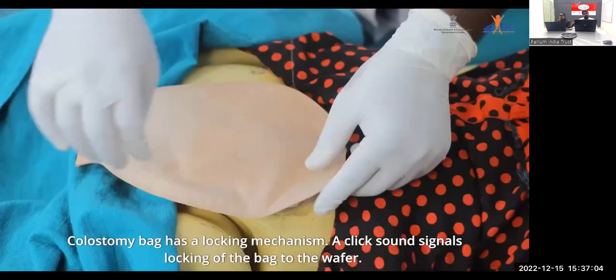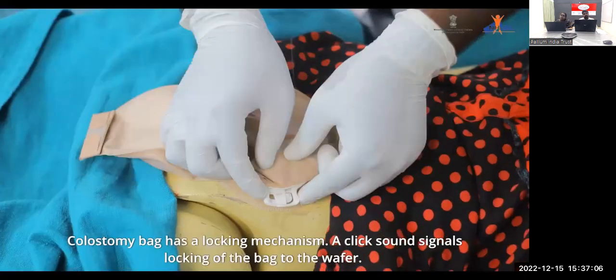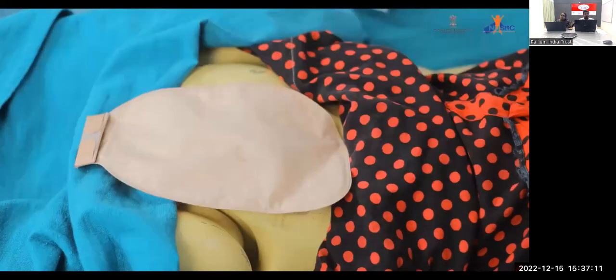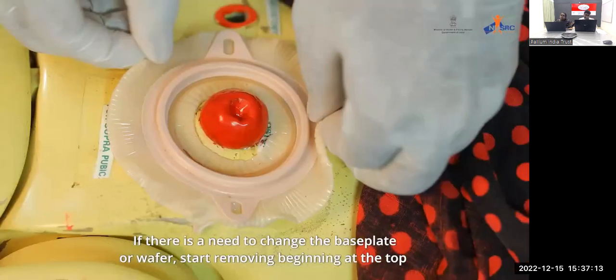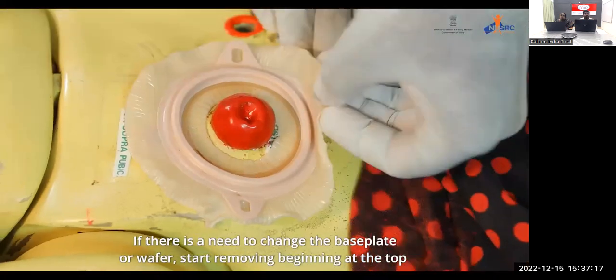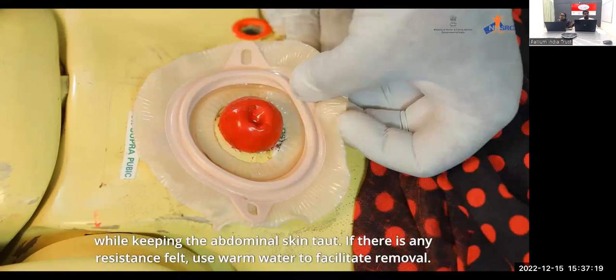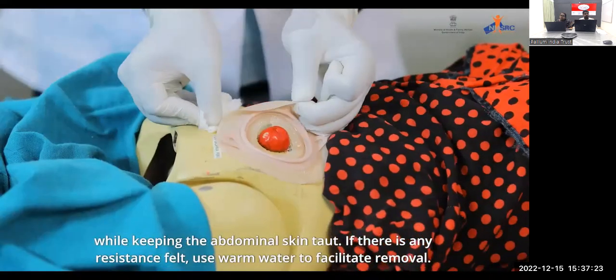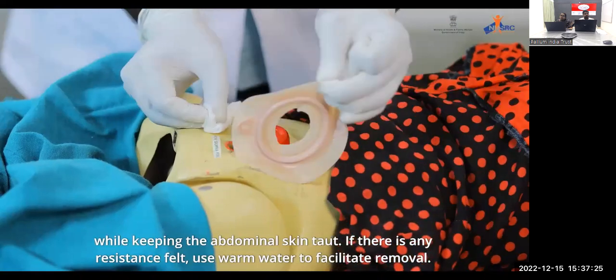The colostomy bag has a locking mechanism. A click sound signals locking of the bag to the wafer. If there is a need to change the base plate or wafer, start removing beginning at the top while keeping the abdominal skin taut. If there is any resistance felt, use warm water to facilitate removal.